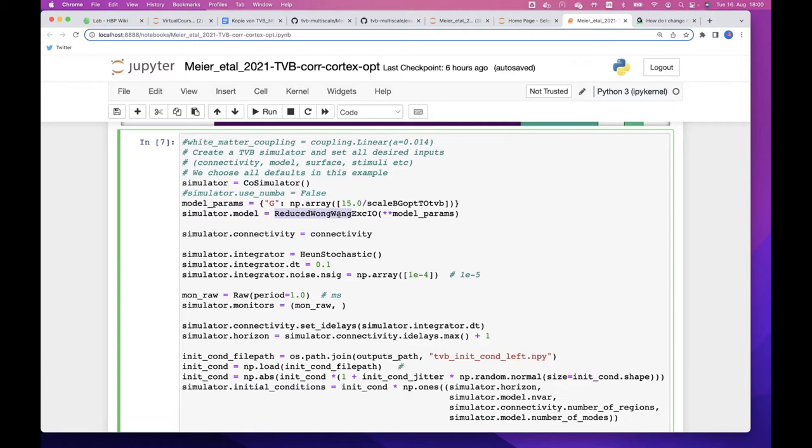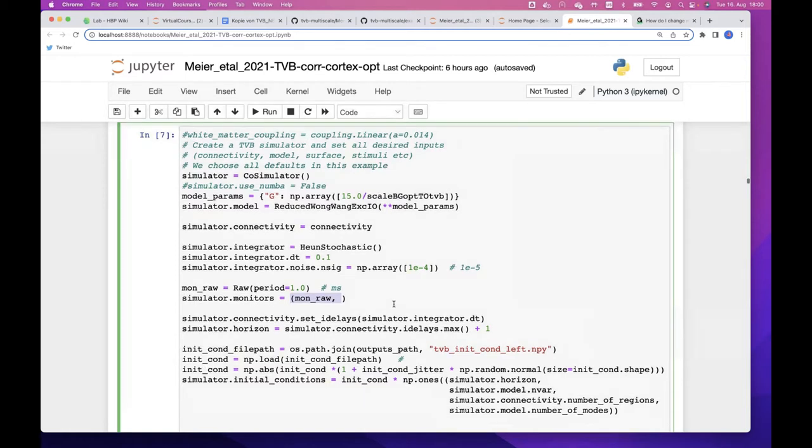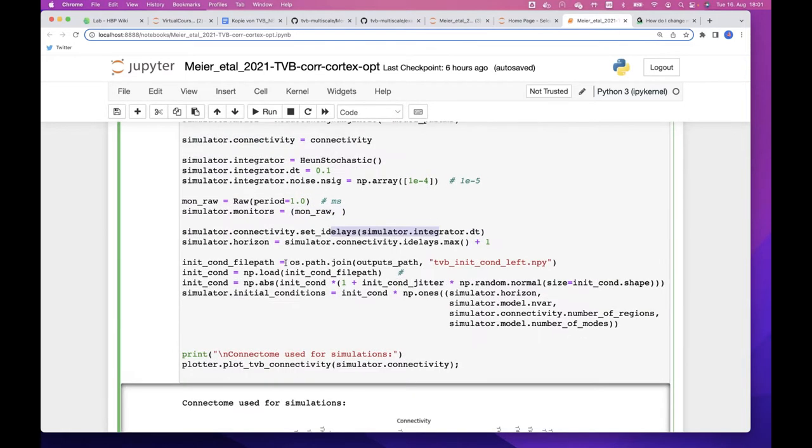But luckily for us, in the literature, they found that the basal ganglia in Parkinson's, once it's not working the way it's supposed to, seems to be quite symmetric on both sides. That's why you often also see that the settings of the DBS electrodes are similar, right and left hemisphere. All right, so again, we are scaling a bit the connections here. This is a global scaling factor, and the interface factor is going back and forth. So you can see here, for example, parameter G, coming back.